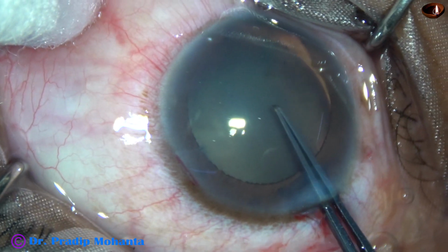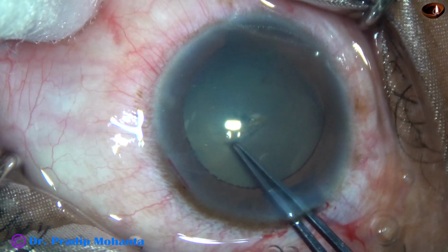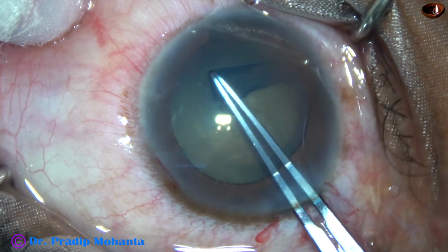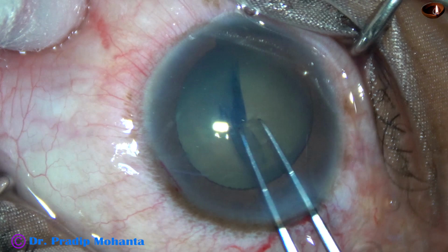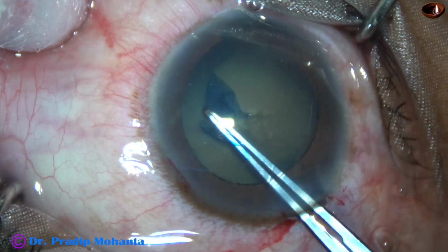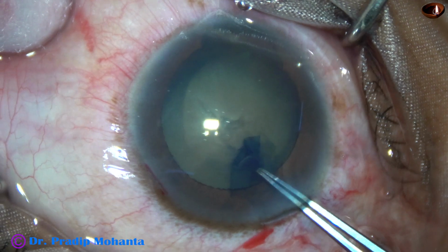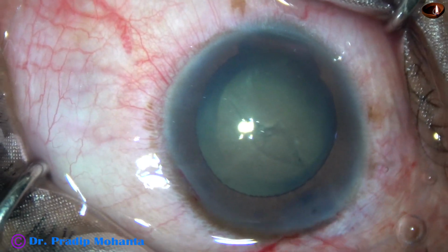So I start doing capsulorhexis with the help of this Utrata forceps. There is a zonular dehiscence at 6 o'clock, but rest of the zonule is okay, quite strong. So I may not have to use a capsular tension ring in this case. So rhexis is being done slowly without any jerky pull, and here it is, the rhexis is complete. Size of this rhexis is about 5 millimeter.